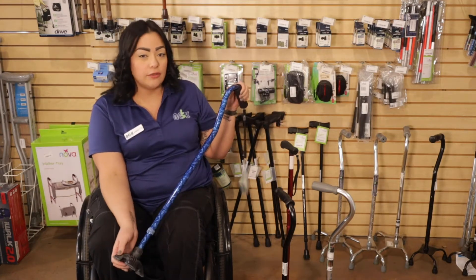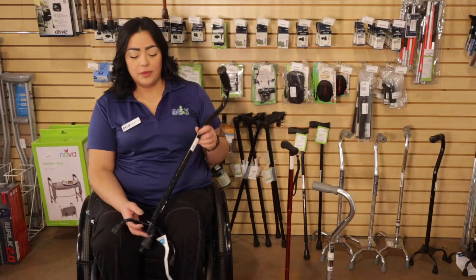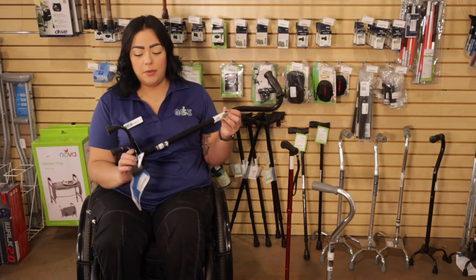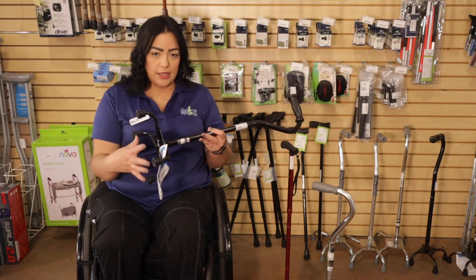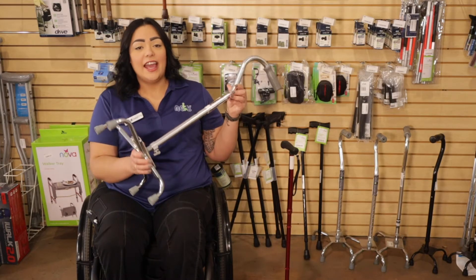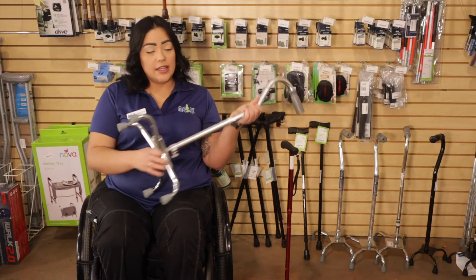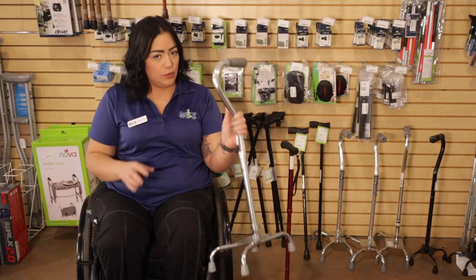Depending on what you're needing for your stabilization, they go from four prongs — this is one of the smallest ones. This one here is going to be the medium. It still has the four, it's just a little bit wider on the base, so you have a little more stability. And this one here, it's the biggest base. It still has the four, but it's wider at the bottom, so you're definitely more stable with this one.